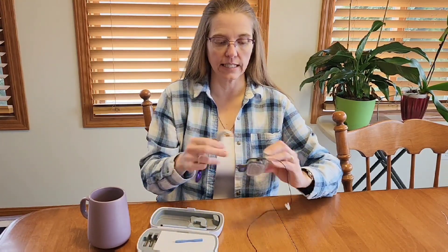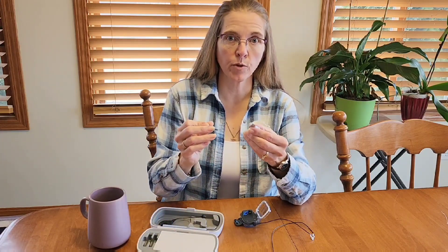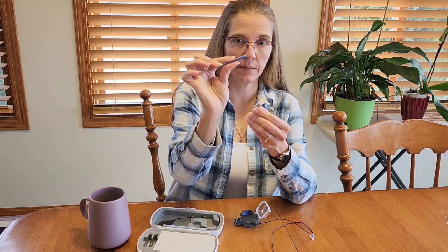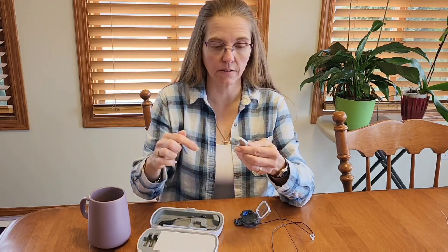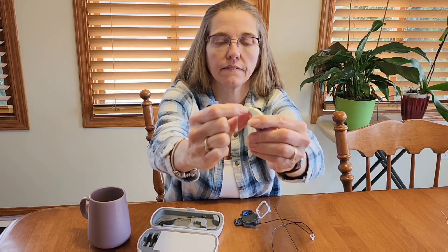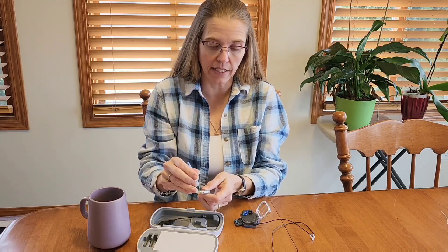I've got that already assembled, so the first step is to take the headpiece off of your processor and then remove the t-mic. It's important to use the blue t-mic removal tool because this is the Marvel one and it helps ensure that the pin does not come all the way out. There's a very small little hole right at the end of where the ear hook clips in.